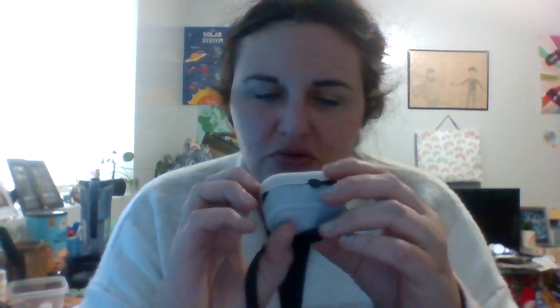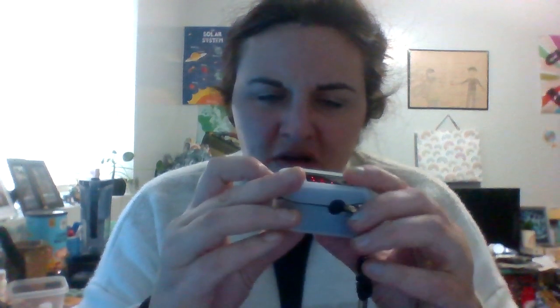But the oximeter, this is a handy-dandy little tool. I got this from my doctor. It requires 2 AA batteries. I check it about 4 times a day, but you just put your finger in it and you wait. Also, you cannot have dark colored nail polish on your finger or it will not read accurately. This says my heartbeat's at 85 and my oxygen level is at 97, which is good. If my oxygen level gets to 90, I need to go to the doctor because that's not healthy.